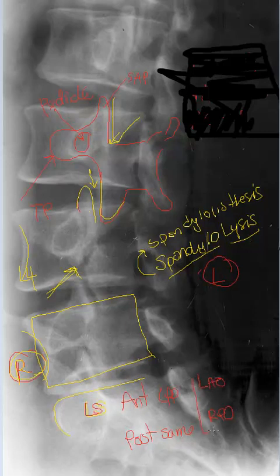That is as far as we can deduce from this particular radiograph. We can't tell if it was taken as an anterior or posterior oblique, but we know from the visualization of a right-sided Scotty dog that those two projections are the only possibilities. I hope this tutorial was helpful for you — please join us again for future tutorials. Thank you.